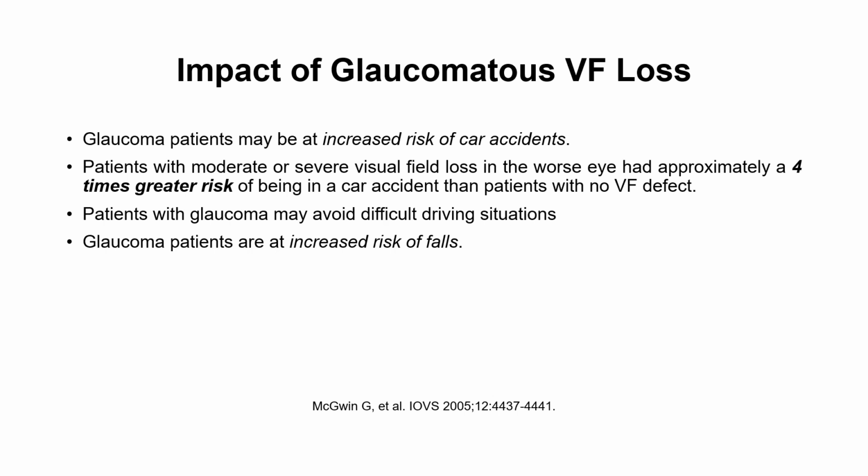Because of the visual field loss, many patients with glaucoma avoid difficult driving situations, and they are also at increased risk of falls. So if there is increased risk of car accidents, increased risk of falling, and avoidance of difficult driving situations, it's very important to understand the visual field in glaucoma patients.